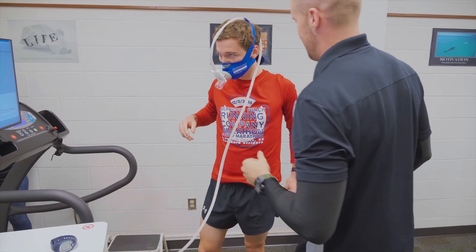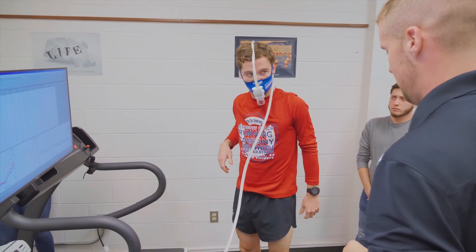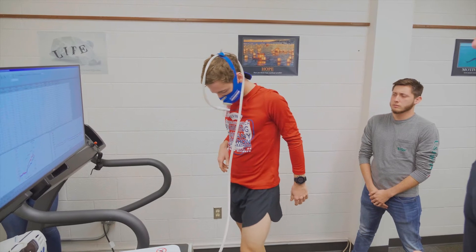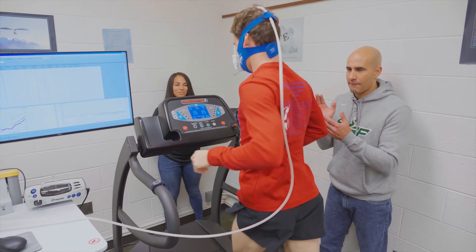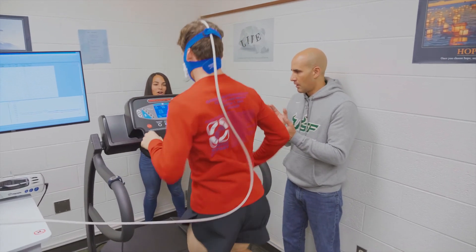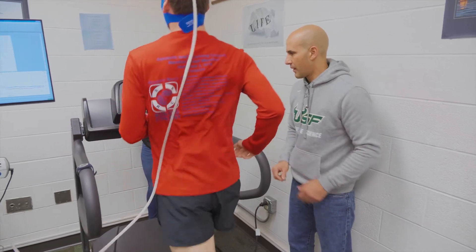A VO2 max test measures an athlete's capacity to utilize oxygen to perform work. What we do with VO2 max testing is put them either on a treadmill or on a bike, and we hook them up to a mask which is connected to an analyzer so we can see how much oxygen they're consuming and how much CO2 they're producing, in order to gauge their work capacity for a given exercise.